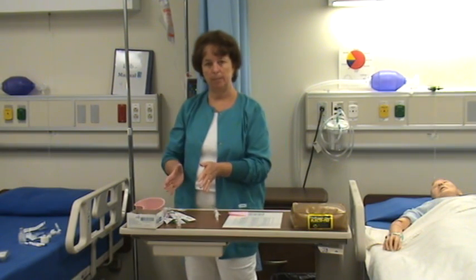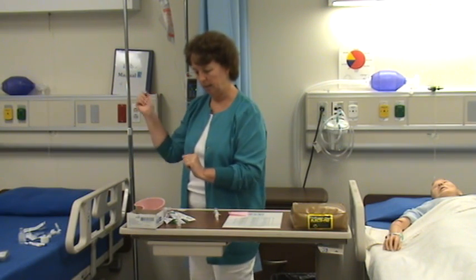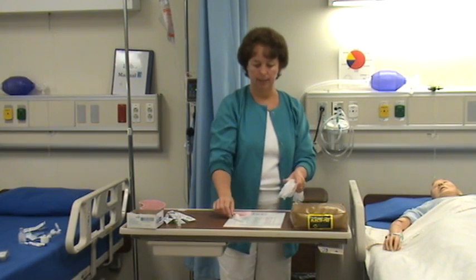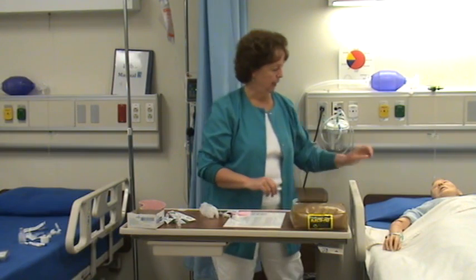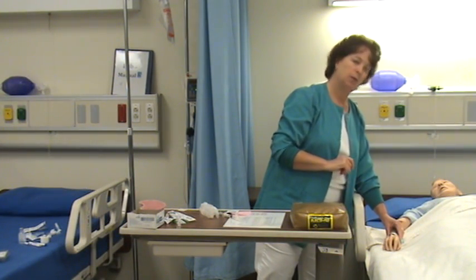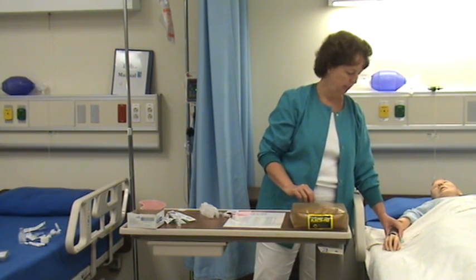At this point I'm going to go to the patient's bedside. I go into the room, wash my hands, pull the curtain around, and provide for privacy. I have my MAR with me, the medication, and an alcohol swab. I go over to the patient, explain what I'm going to be doing, and use two identifiers to make sure I have the correct patient, then do my last five rights check.